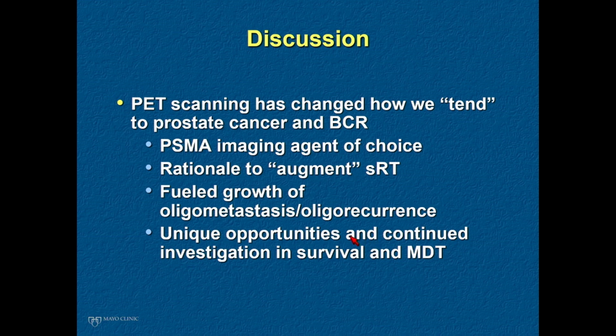There certainly is rationale to augment our salvage radiation and how we refer to radiation oncologists with the introduction of PSMA PET scan. It's fueled the growth of oligometastatic disease or oligo-recurrent disease, and certainly there are unique opportunities for us and our patients with continued investigation in survival benefits of intervening on oligo-recurrent disease. So thanks, open for any questions.